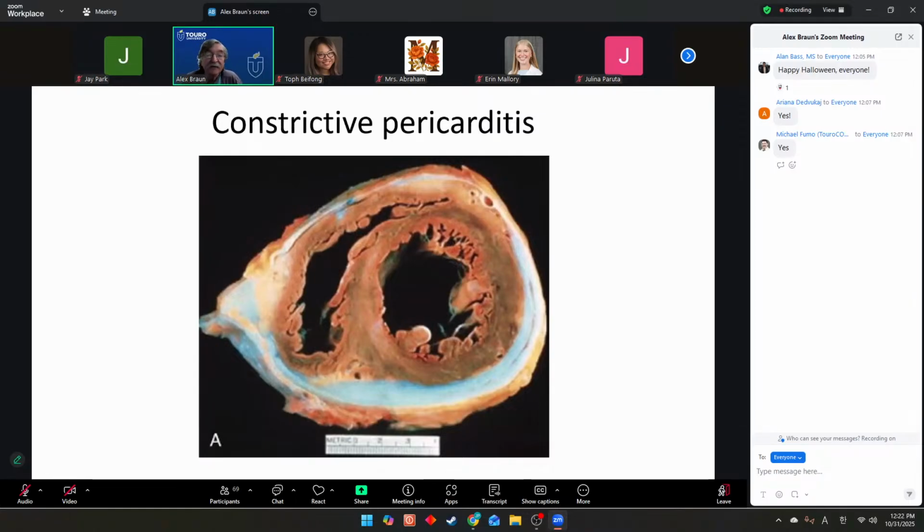Sometimes because of inflammation, or because of tumor metastasizing to the pericardium, or because of old hemorrhage or old surgery, there may be some scarring or fibrosis of the pericardium. The pericardium gets thickened, and the layers of visceral and parietal pericardium may even get adherent, or stuck to each other, like you see here, so that the pericardial space becomes obliterated. You're seeing that in this particular image. The pericardium overall is thickened. The pericardial space has been obliterated because of adhesion between visceral and parietal layers.